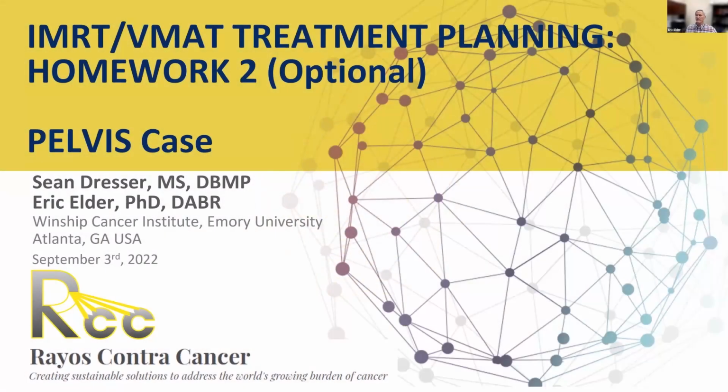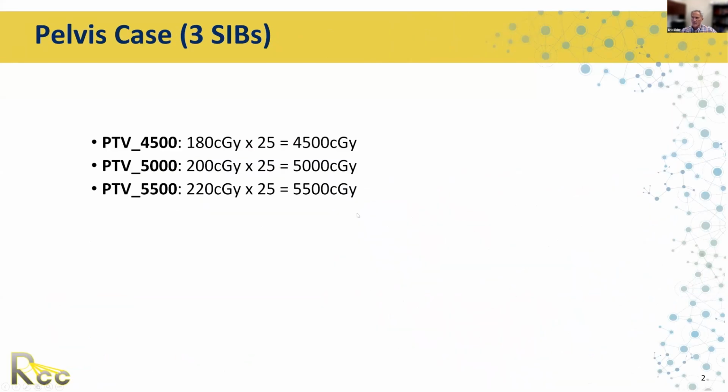So today we're going to review the case that you all turned in, the IMRT or VMAT treatment planning case that involves a simultaneous in-field boost. To recap, the case involved three PTVs: a PTV 4500, a PTV 5000, and a PTV 5500. All of them were receiving 25 fractions. Again, this is a simultaneous integrated boost.